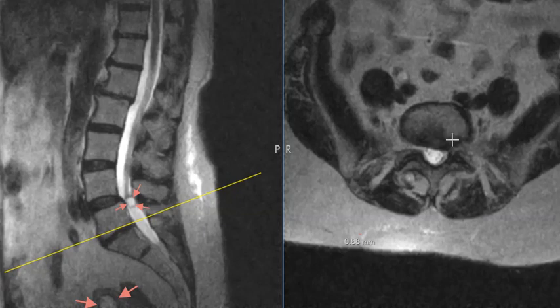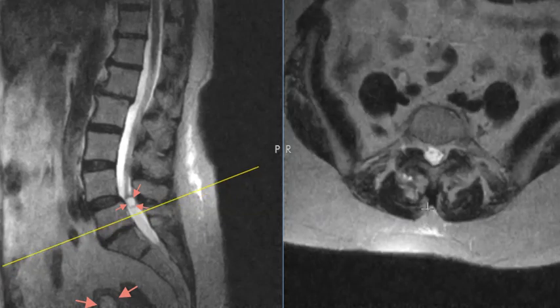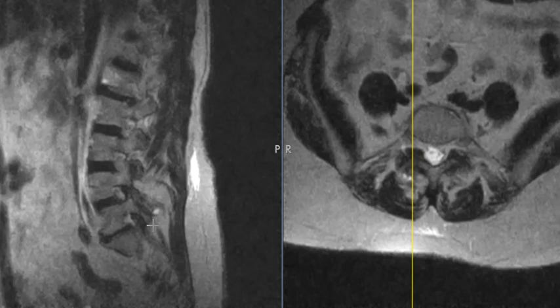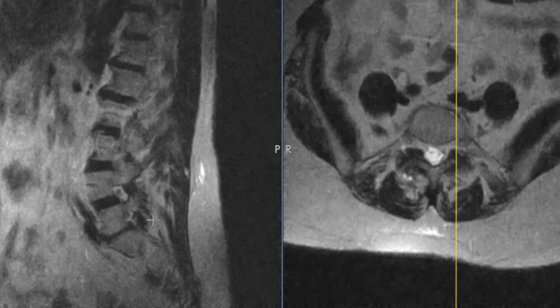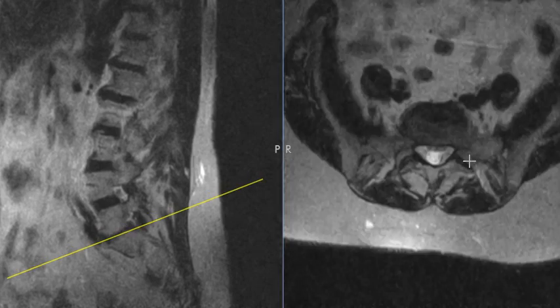This is the vertebral body here. We can see from a side view, if I go to mid-body, here's going right through the vertebral body. Here's the vertebral body. And if we roll off to the sides, we see a facet joint in back. And this is that facet on the right and back. We're going to go to the left side. Here's a facet in back. Here's the facet in back to get the anatomy down.